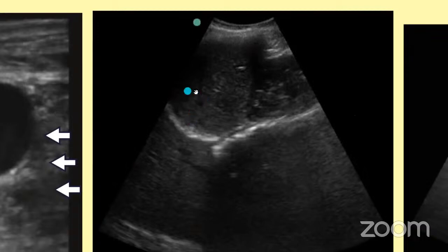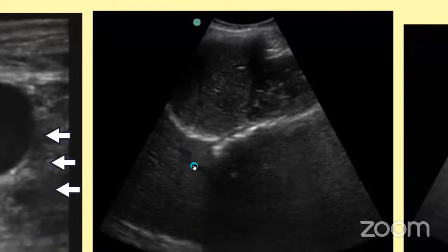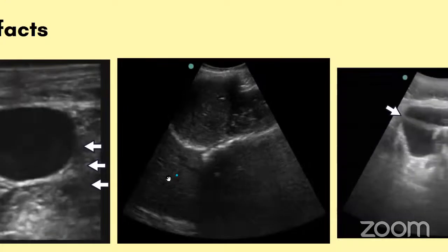So this produces a virtual image behind the diaphragm. Thus, we are getting a liver-like image here. We can also appreciate a lot of sinusoid-like things. So this is more of a delusional thing. This does not exist. Above the diaphragm, we cannot have liver in physiological senses.